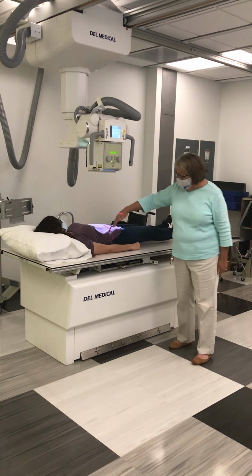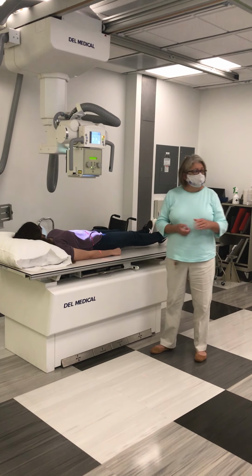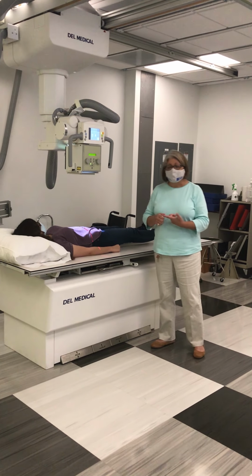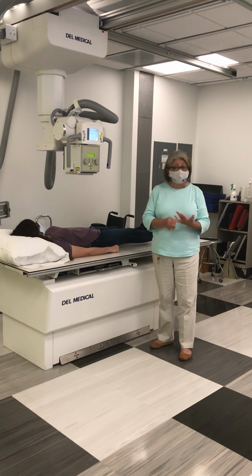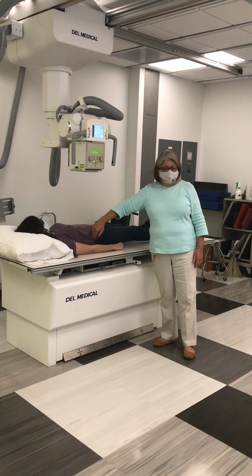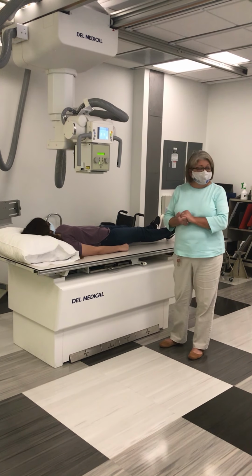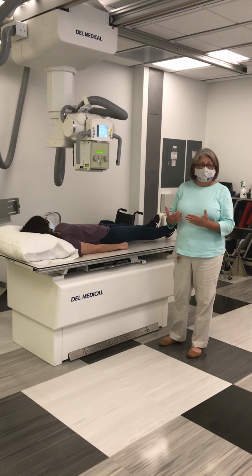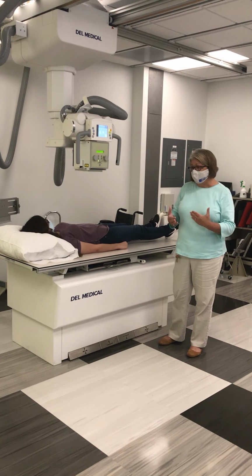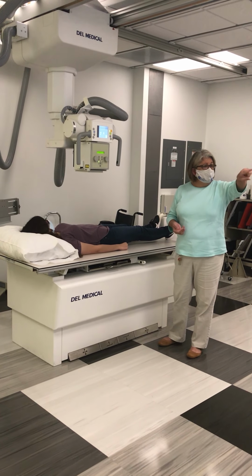Okay, by centering at the iliac crest, our goal in this, remember, is to include the kidneys, ureters, and bladder on this image. If I center at the iliac crest, then I should include the entire bladder. Now, an indicator that tells us that the entire bladder is included is when we demonstrate the symphysis pubis on that image.